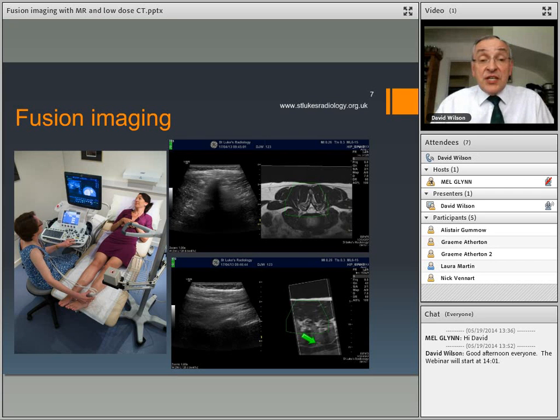You can rotate them as you wish, you can move it in any direction, and it moves as fast as the ultrasound does. That means we can see the soft tissues, we can look at Doppler, look at the neovascularity. At the same time, we can see the MR rotating in the same direction. So how do we link these images together? Well, that takes probably about 5 minutes.